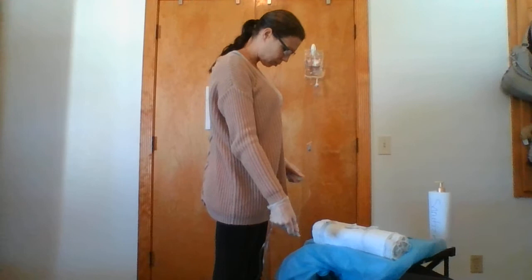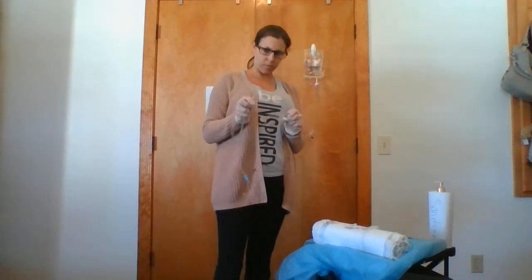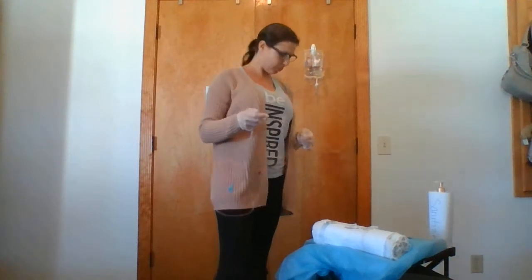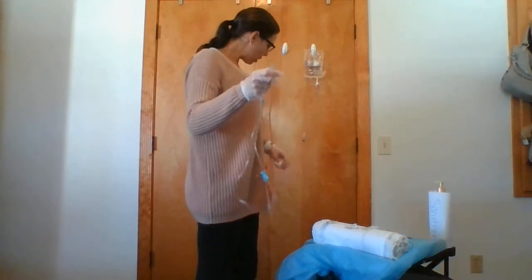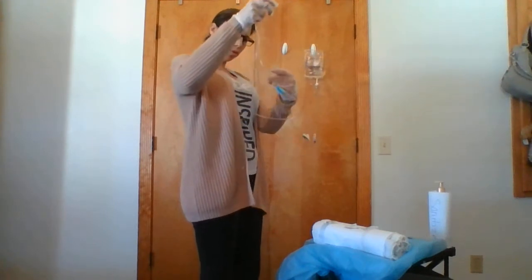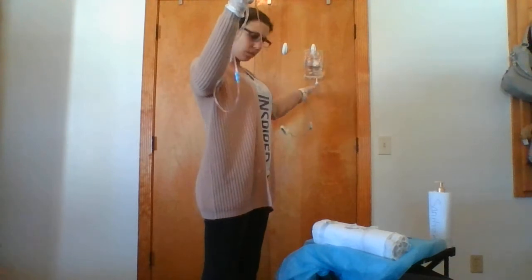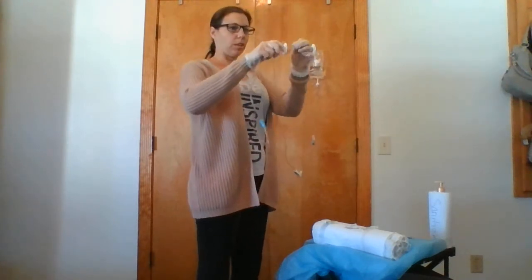Once the IV tubing is primed, you can do this with the cap on or cap off. Take the cap off, you need to hold on to it. You're going to assess your sites and your tubing to make sure there are no bubbles. If there are, you're going to advance them upward, back up into the chamber. I'm going to reclamp.